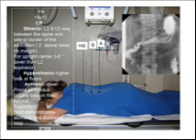For the hypersthenic body habitus, a tube angle of 35 to 45 degrees cephalic will allow better visualization of the greater and lesser curvatures and duodenal bulb. For infants, a 20 to 25 degree cephalic tube angle is recommended to open up the body and pylorus of the stomach. To demonstrate a hiatal hernia or fill the fundus of an asthenic patient, the patient may be placed in Trendelenburg position. Use shoulder braces.